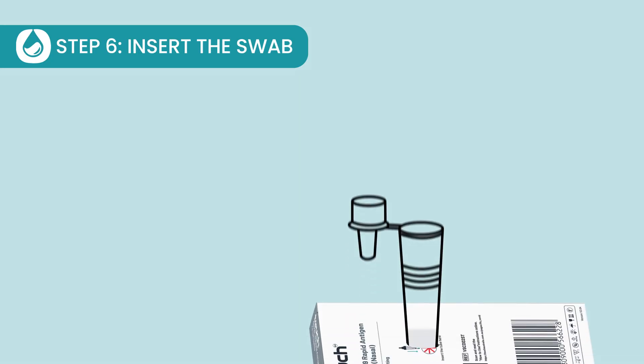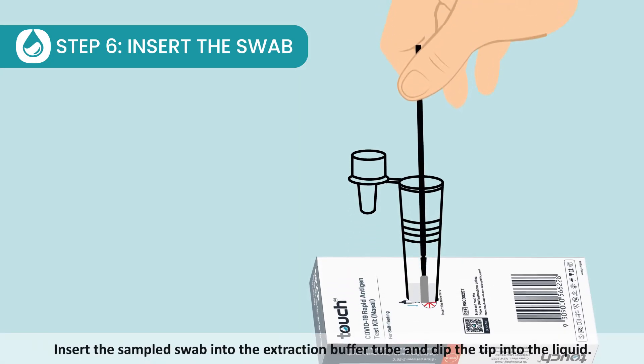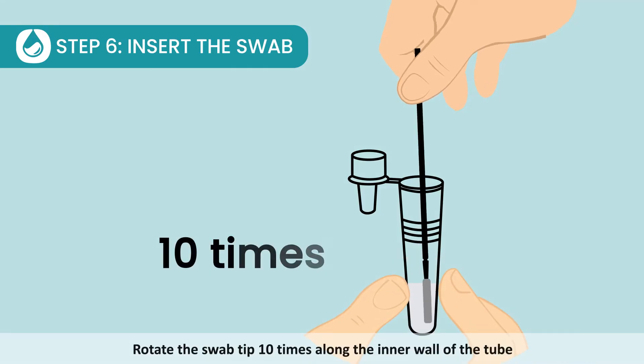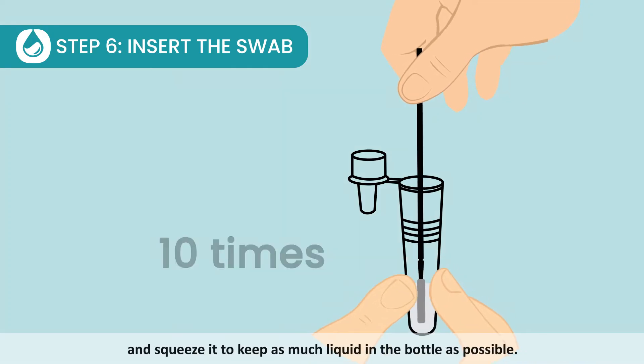Step 6: Insert the swab. Insert the sample swab into the extraction buffer tube and dip the tip into the liquid. Rotate the swab tip 10 times along the inner wall of the tube and squeeze it to keep as much liquid in the bottle as possible.